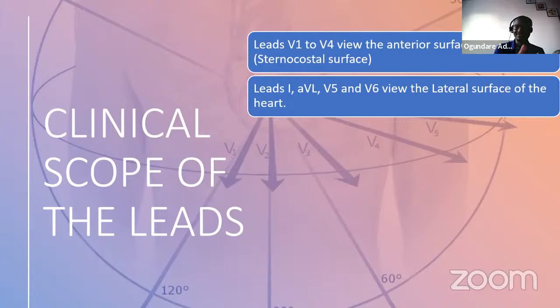Okay, so we have lead 1, AVL, V5, and V6 telling us the lateral surface of the heart.